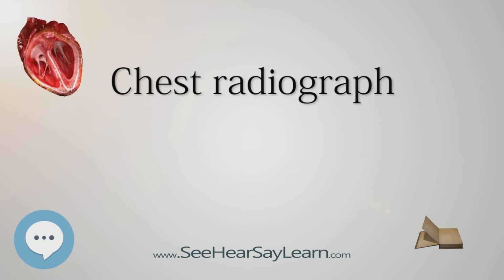Limitations. While chest radiographs are a cheap and relatively safe method of investigating diseases of the chest, there are a number of serious chest conditions that may be associated with a normal chest radiograph, and other means of assessment may be necessary to make the diagnosis. For example, a patient with an acute myocardial infarction may have a completely normal chest radiograph.